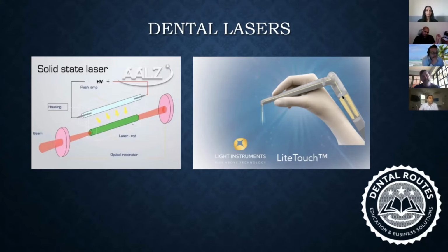Okay, so where do they pass out? This is the point where they pass out. Once they are passed out of this resonator, it goes and hits the mirror on the end of that tunnel. Then it's reflected to the next one, and the whole process happens, and this whole beam of laser, which is amplified. Now I'm again going back to the definition. What is it? It is an amplified light of a single wavelength.